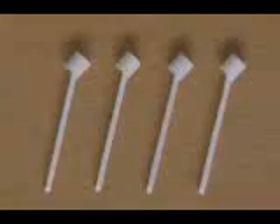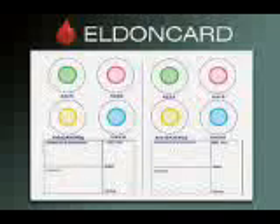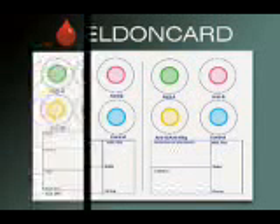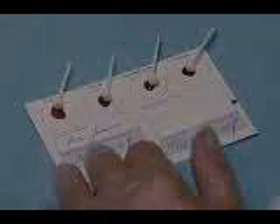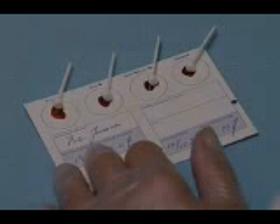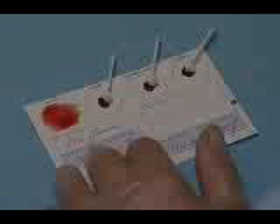The alternative to using the Eldon comb is to use four Eldon sticks. Eldon sticks can be used on any type of Eldon card — in particular, the double and triple Eldon cards, where the comb is not suitable. Make sure to use a separate Eldon stick for each circle on the card. Add the blood to the water and leave the stick in the circle. Press the stick in the ANTI-A circle firmly against the card and stir the blood until the reagent has dissolved, making sure to smear the blood out to the edge of the circle. Discard the Eldon stick and repeat the procedure with the other three circles.